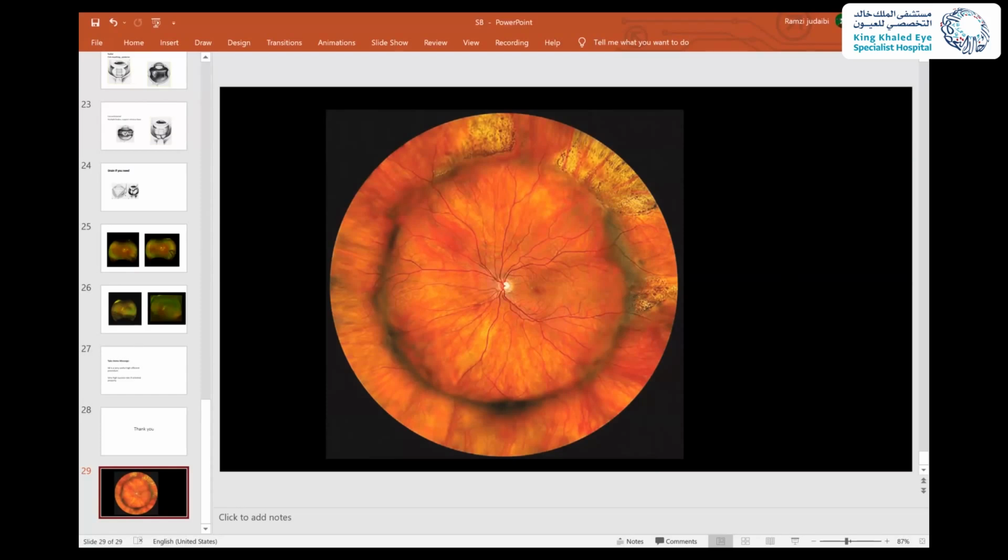For example, nowadays there's this tendency to do chandelier assisted buckles. This is something that in the old days, they couldn't do. It had to be done with an indirect. What's your opinion? Do you have a preference between chandelier buckles or the traditional indirect buckle with cryo?